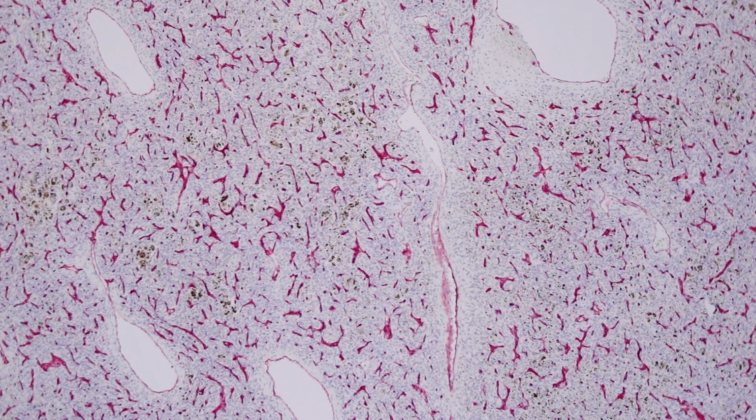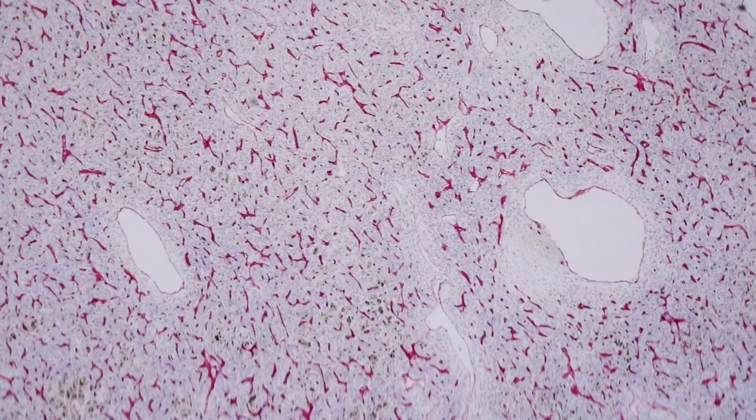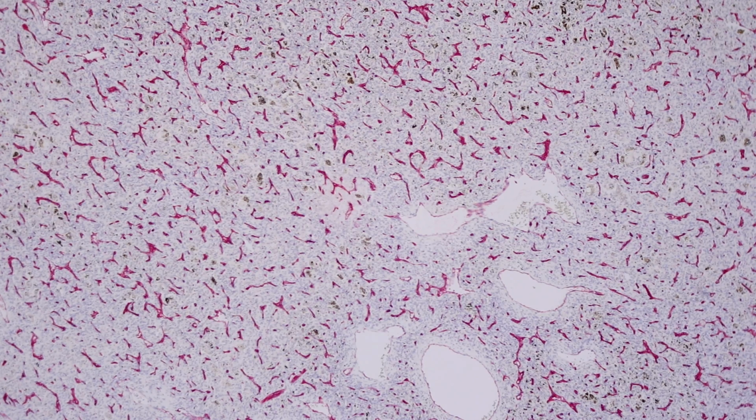Those can be challenging because obviously a lot of the features that I've been teaching in this video are all about looking at the periphery of the tumor, the deep aspect of the tumor. A lot of our clues come from those areas. And I have rarely seen cases of DFSP that had a lot of features like dermatofibroma and vice versa, but those cases to me are a minority.